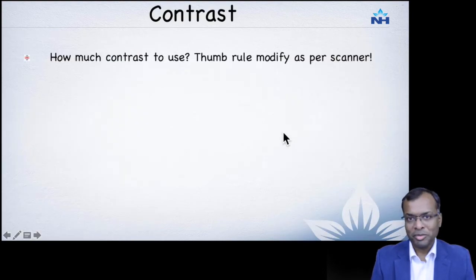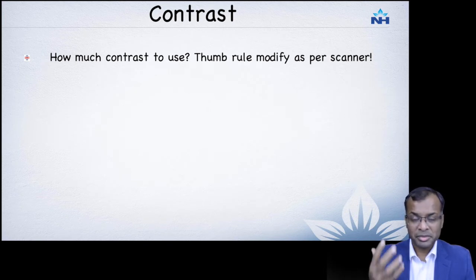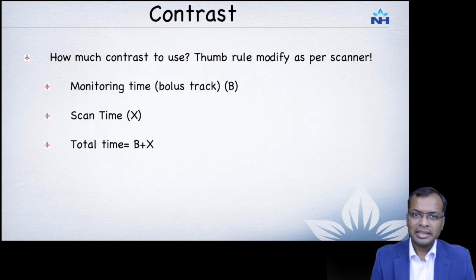This is a very important question, and that is how much contrast to use. Is there a thumb rule that we can apply to say this much contrast should be given as per a scanner? Well, an easy way of looking at this is to look at the amount of time the scan will last. From the scanner, you plan the scan and it says it's going to last for 10 seconds.